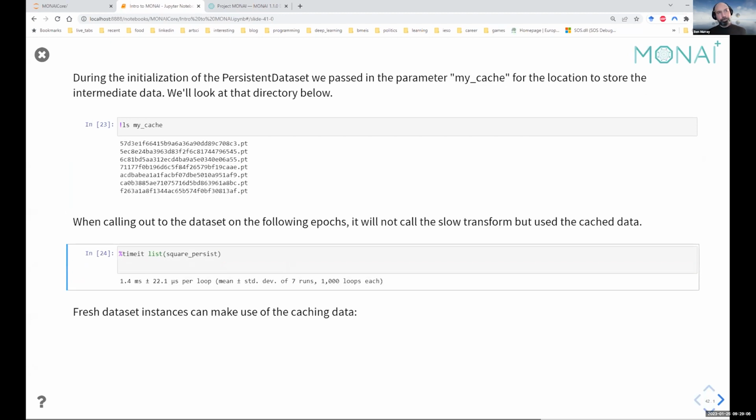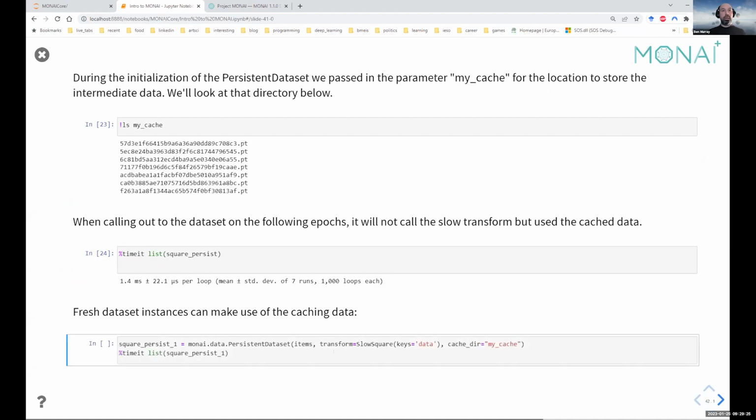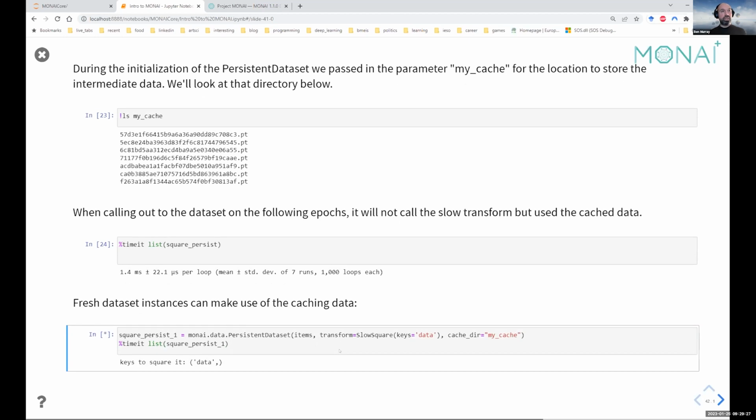So now, this can be a bit of a double-edged sword. On the one hand, once you have your cached directory, you can use multiple instances, and that allows you to, for example, train multiple instances simultaneously from the same cache folder, which can be nice, provided that's what you intend to do.